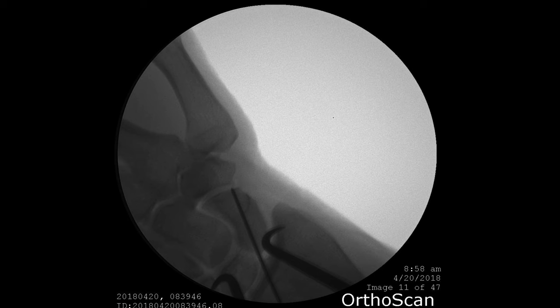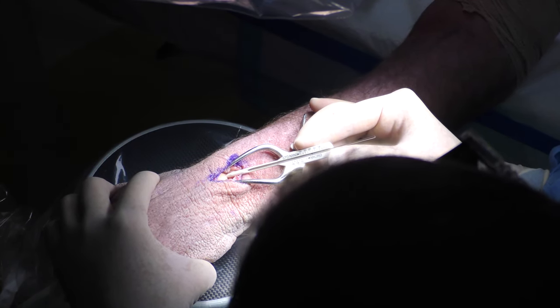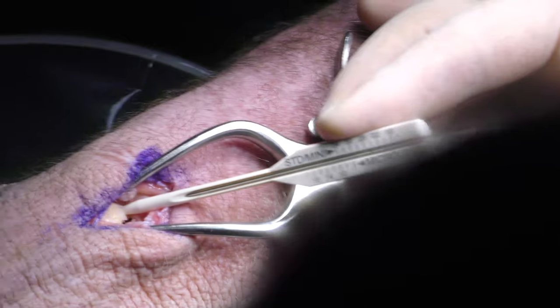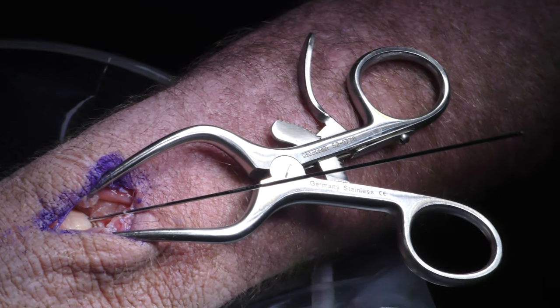This lets us get an appropriate measurement for the screw. Okay, so we use the depth gauge, and on the depth gauge, we want to put a mini in. It's up on the top part, and it measures on the guide. It's measuring probably a 24, and a little bit more than a 24, so we take off 4. We should put a 20 in. We could probably put a 22, but let's put a 20 in.